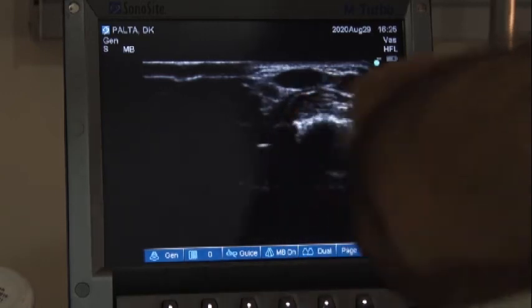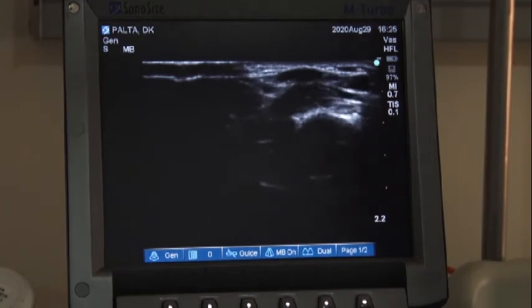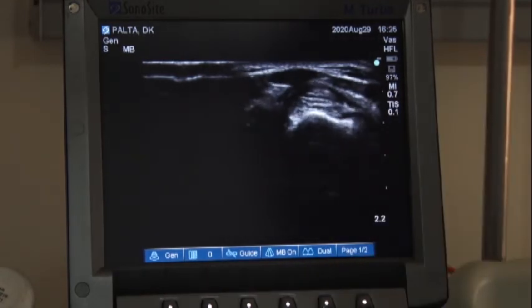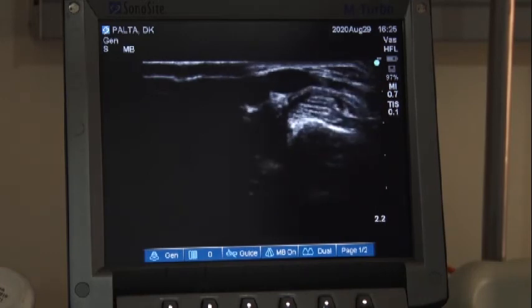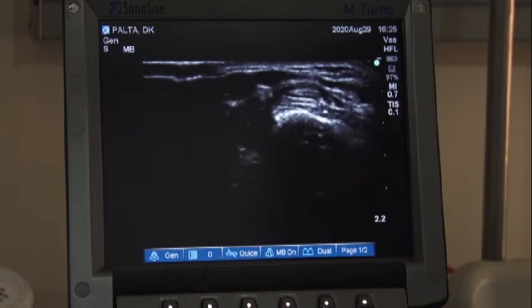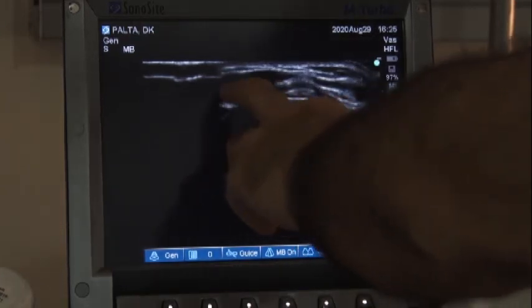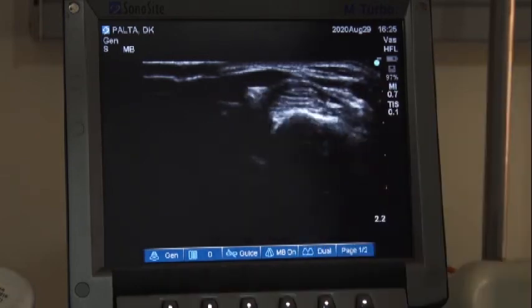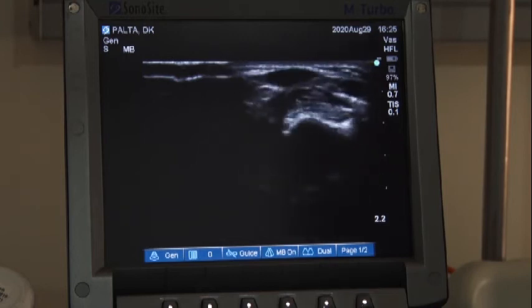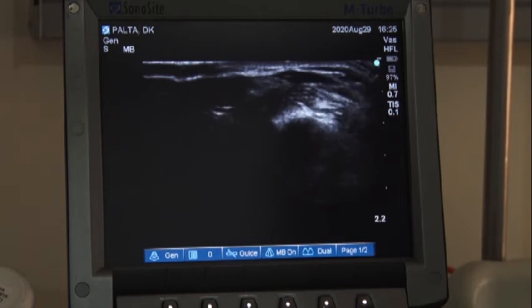This one is having a peak systolic velocity of 120, 130. This one is having a peak systolic velocity of 150. And the flow in this is around 180 ml, 150 ml, and this is actually around 150, 160 ml. And there's a minimal flow in this. So this is probably the accessory vein, which is not tied. Actually, this branch has not been tied during the surgery.